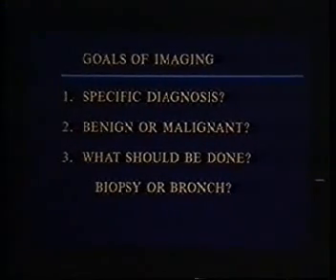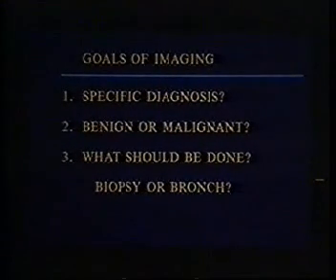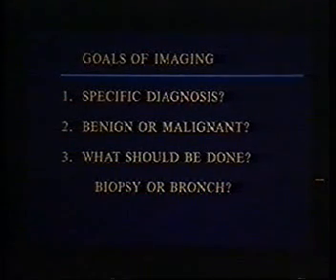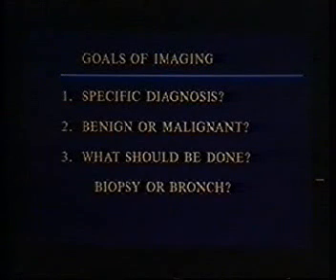Now, in imaging a solitary nodule, there are really three questions we're trying to answer, regardless of what technique we're using. The first thing is, can we make a specific diagnosis? Can we look at the plain film or CT or whatever and diagnose the abnormality as something specific that does not need further evaluation?